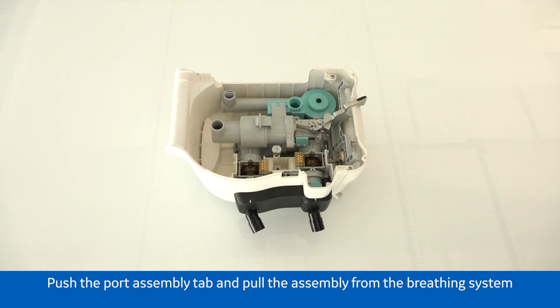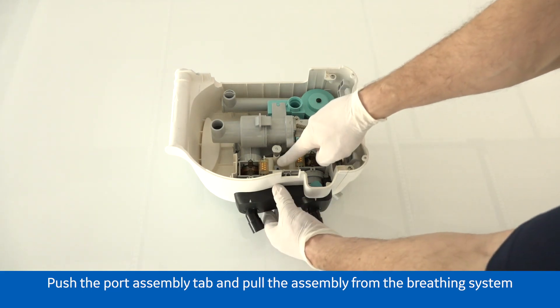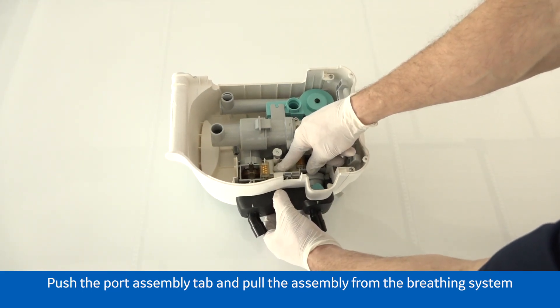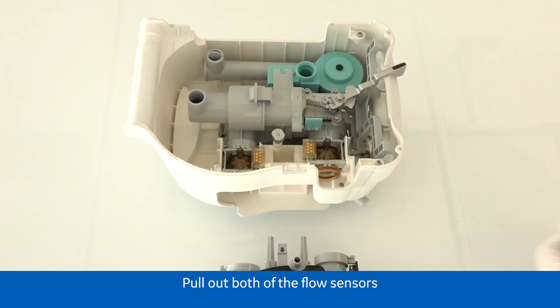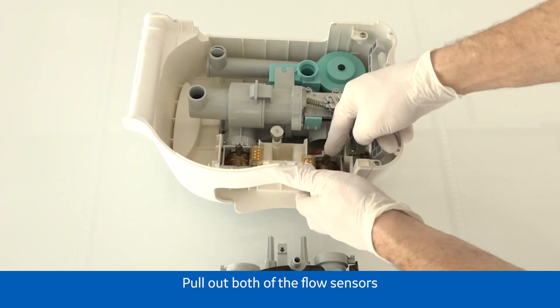Push the patient port assembly tab and pull the assembly from the breathing system. Pull out both of the flow sensors.